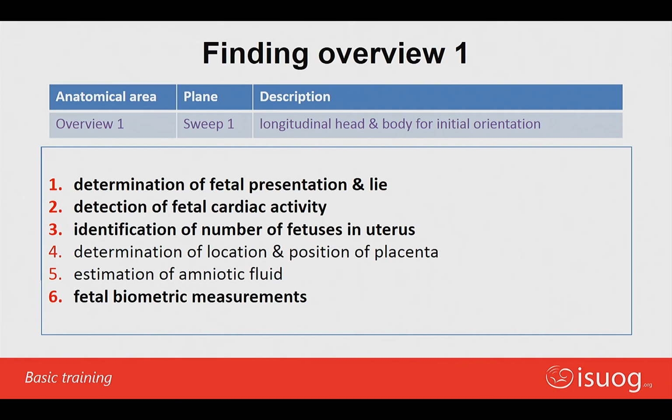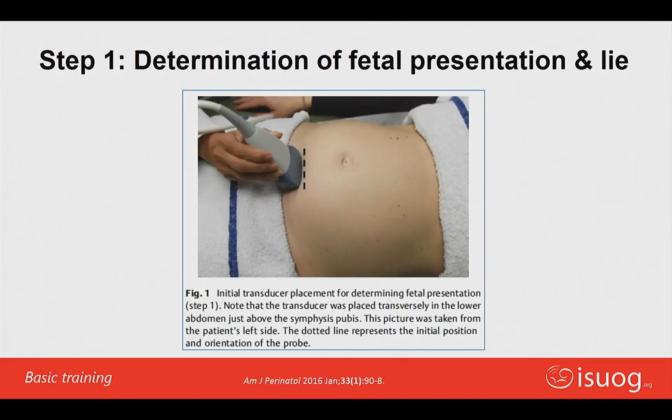of the fetus. And it really revolves around where you start, where you place your probe in the beginning, whether you start with a longitudinal survey of the uterus, or whether you start with a transverse survey of the uterus. And what we're interested in, particularly in today's presentation, is how to determine the fetal lie and the presentation using the 6-step approach. You can look at Alfred's presentation from day one of the program online if you want to.